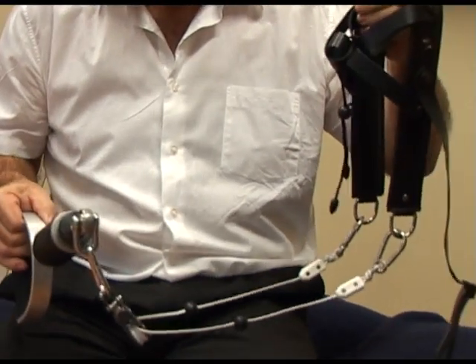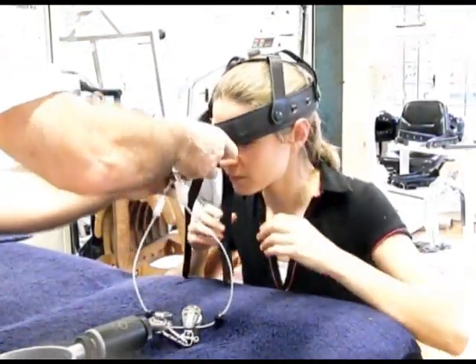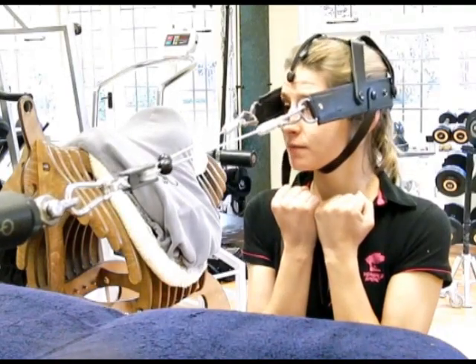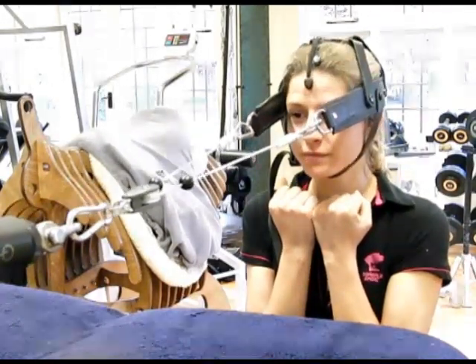We use different forms of applicator — we use a harness or compression plates, and different angle types of compression plate. We then apply this to the body at a fixed position in a reproducible position, and then we either pull or push on the body to create a maximal force.